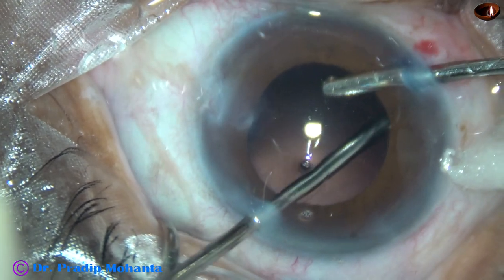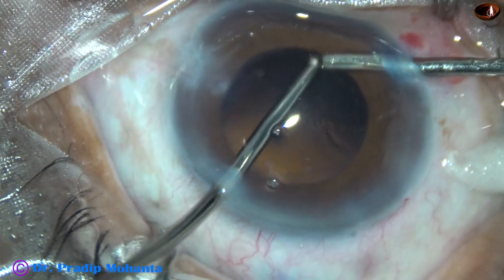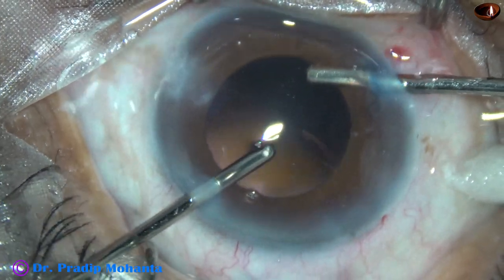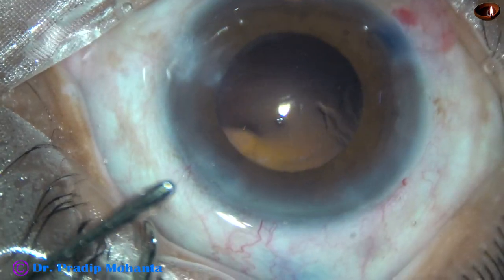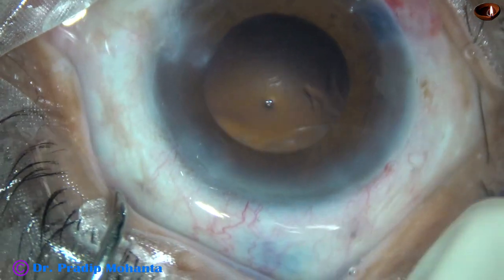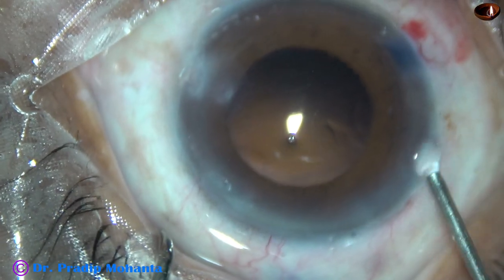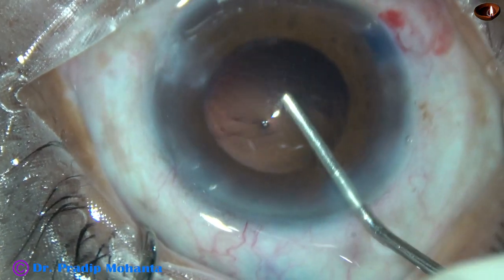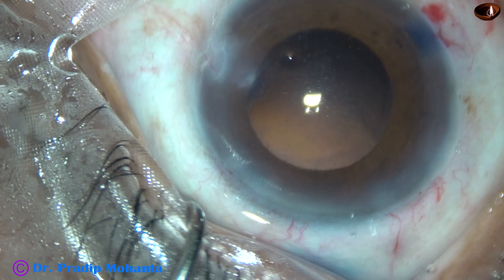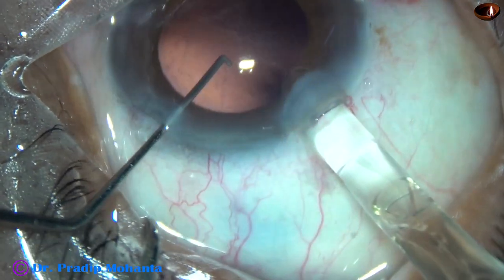Always hold the anterior part of the cortex — that is the cortex which is just under the anterior capsular rim. Hold that portion of the cortex and pull centrally. But always keep an eye on the movement of the capsular bag. Don't give a jerky pull, as that may cause zonular dehiscence if the zonules are already weak.